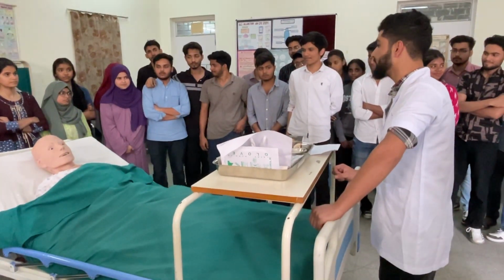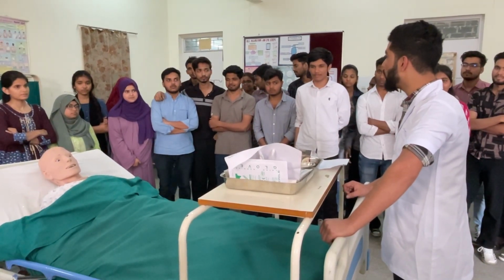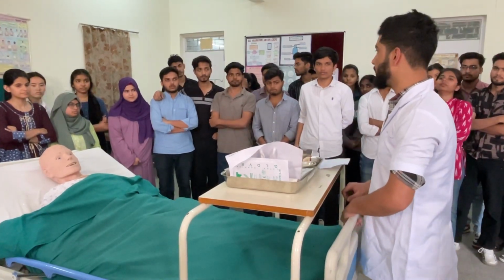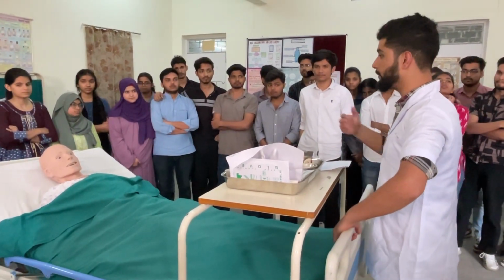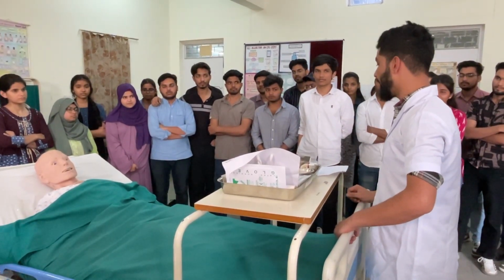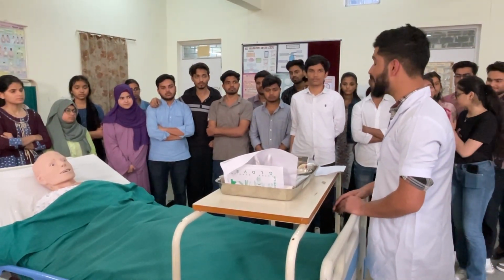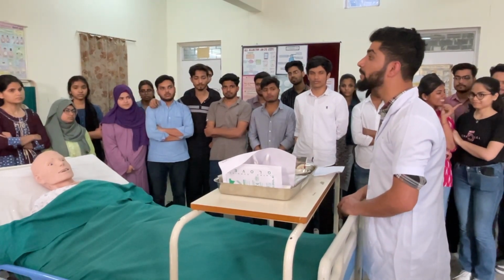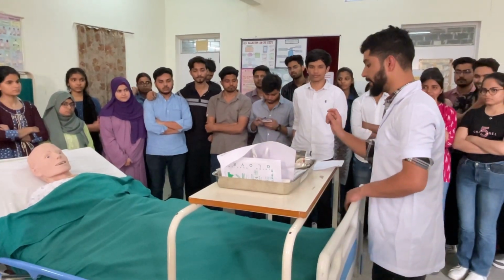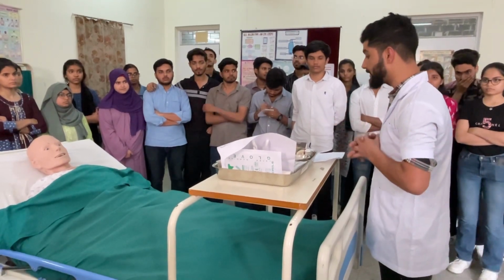Now we are going to demonstrate this very particular procedure, and the procedure is oxygen administration. Before we follow the procedure, there are some instructions which we have to keep in mind. The first instruction is be sure that the client has no matches, cigarettes, or any other smoking material.